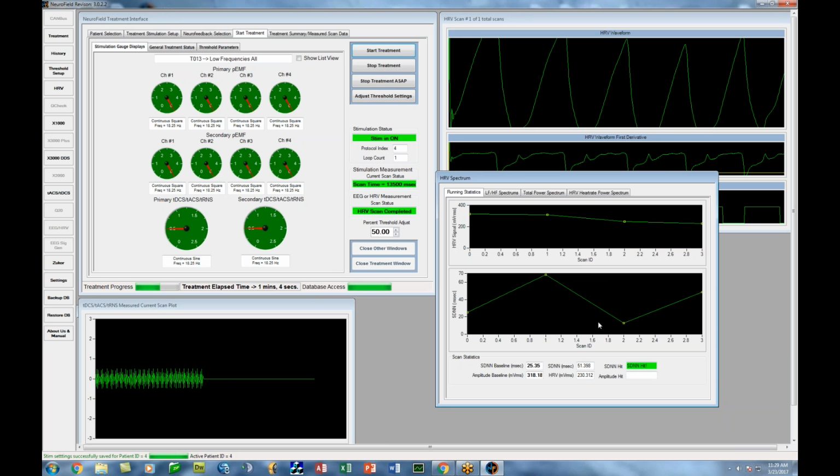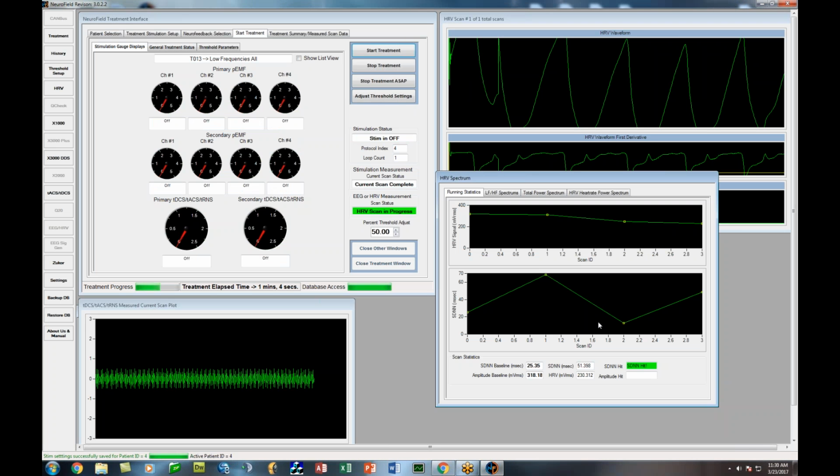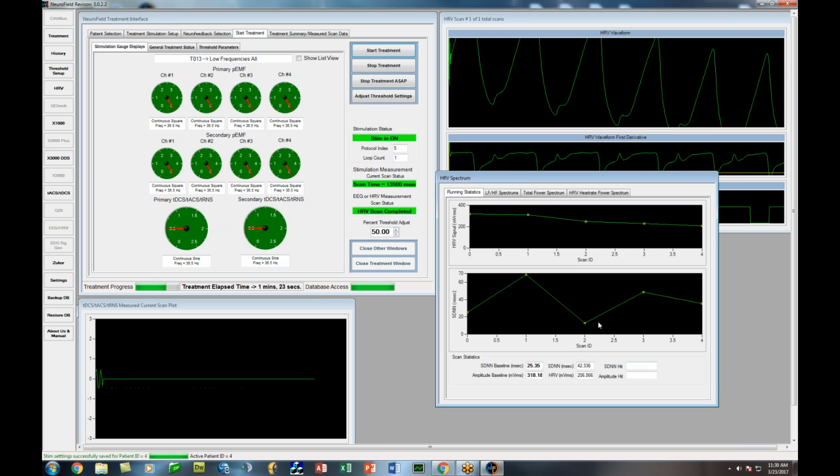This is a gross screening. We want to determine which one of the 7 the body is going to accept or give a yes response to. After that, what we're going to do is select that one that the body says yes to and do a finer resolution screening. The whole procedure takes about 15 minutes to run.